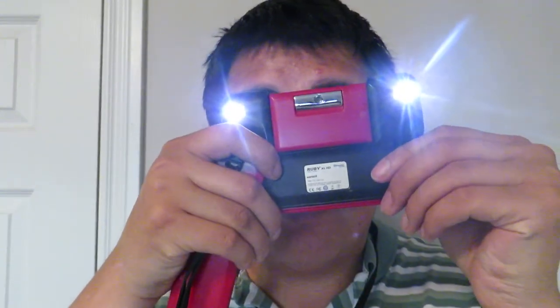The cool thing about it is — I'm going to have to turn it back on here because it shut off. So it has different modes. If you want, you can do all sorts of different modes. You can zoom in, you can zoom out, and it's so awesome.